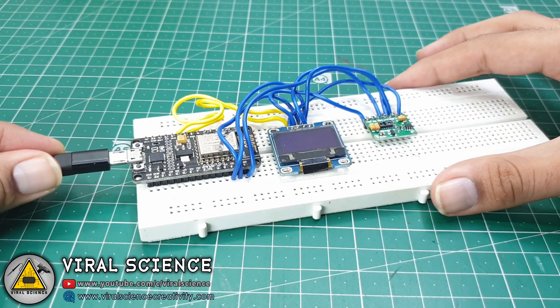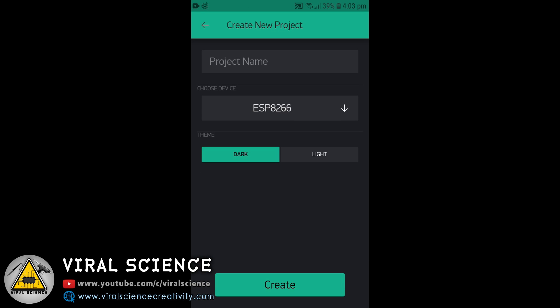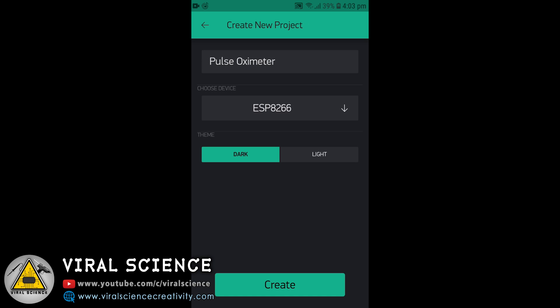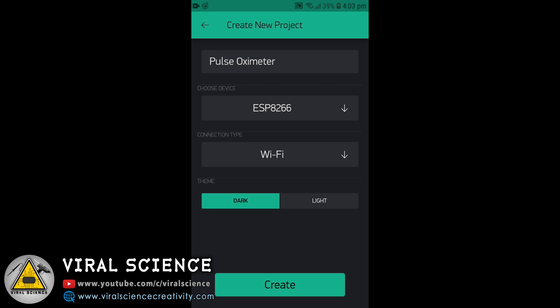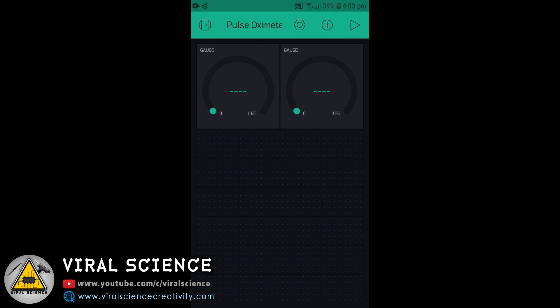Now connect your ESP8266 board with your computer. Download the Blynk application, click on new project, give your project a name — I am giving it 'pulse oximeter' — select the ESP8266 board, click on WiFi and click on Create. Now first we will add a gauge; we will add two gauges and then we will add a value display.